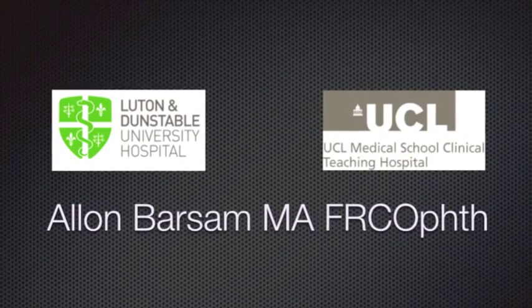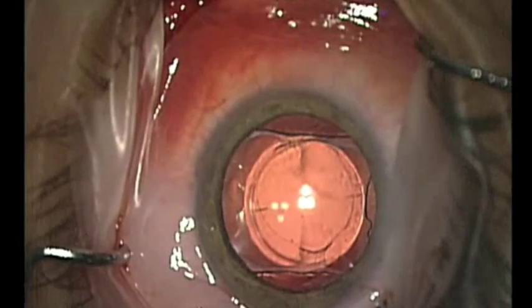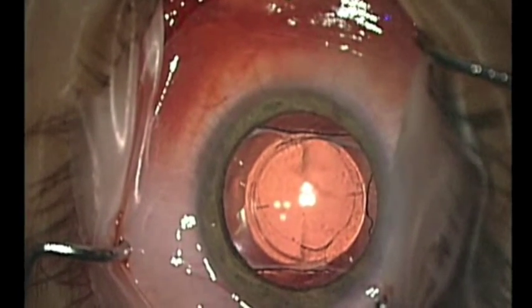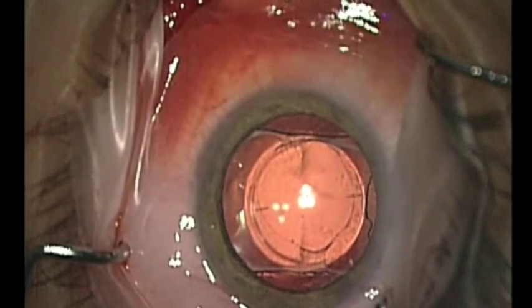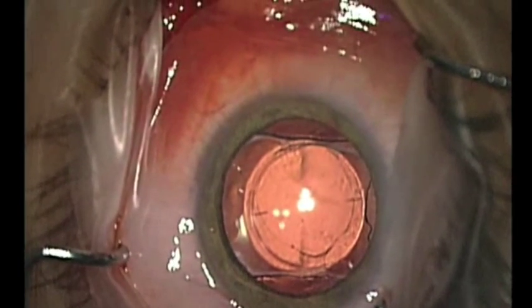I present a new technique for explantation and exchange of a plate haptic intraocular lens. The patient had had initial surgery carried out elsewhere 18 months earlier with a multifocal toric plate haptic intraocular lens and presented requesting exchange of this lens.